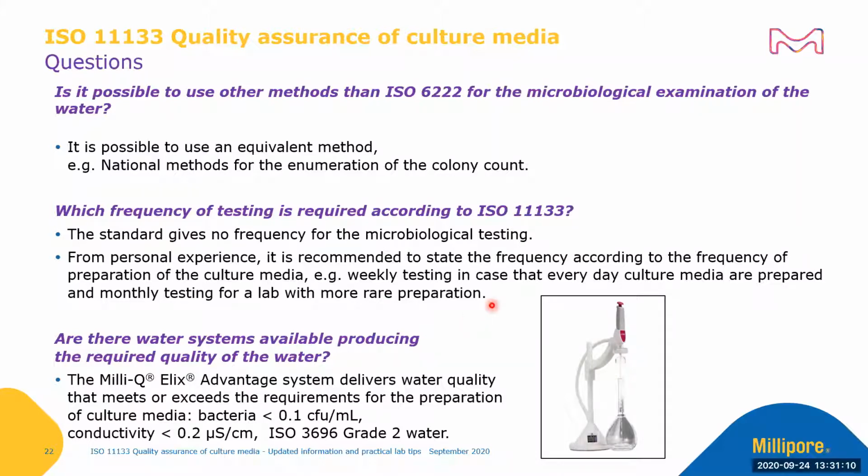From personal experience, it is recommended to state the frequency according to the frequency of preparation of the culture media. For example, weekly testing in case that culture media are prepared every day, and monthly testing for a lab with more rare preparation. Are there water systems available producing the required quality of the water?